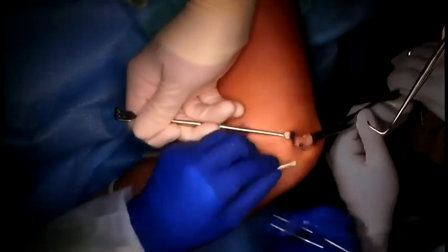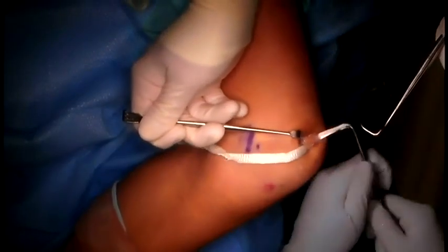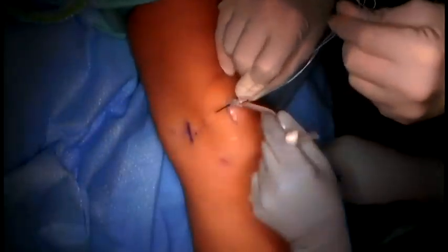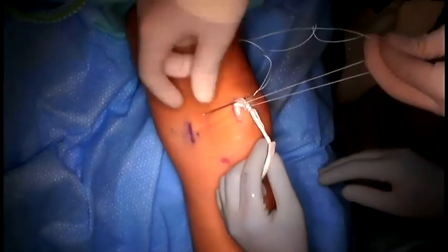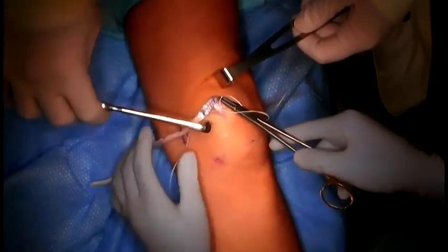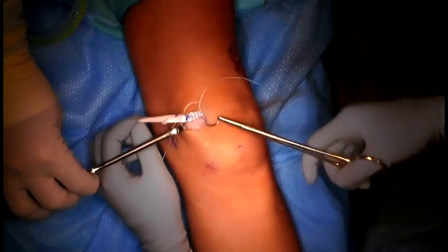The graft is retrieved through these incisions and folded over onto itself. A looped suture is utilized to place a locking suture, ending at the supermedial corner of the patella. One limb of the suture is then passed through the periosteum at the supermedial corner of the patella to secure the graft to this location.